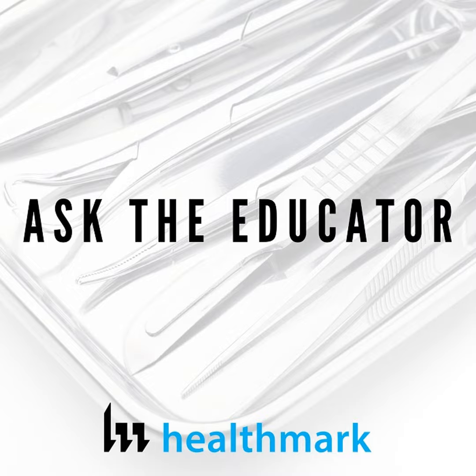So again, a borescope is required in certain IFUs for shavers, or it has strange language like inspect the internal components of the shaver, which is the same thing as saying you need a borescope. And so having the tools, the right brushes, the right borescope, or some type of device that can look inside. And then the training component, make sure that staff understands the usage for it.